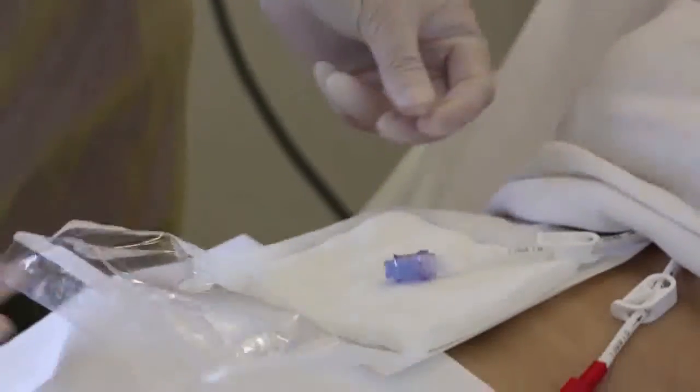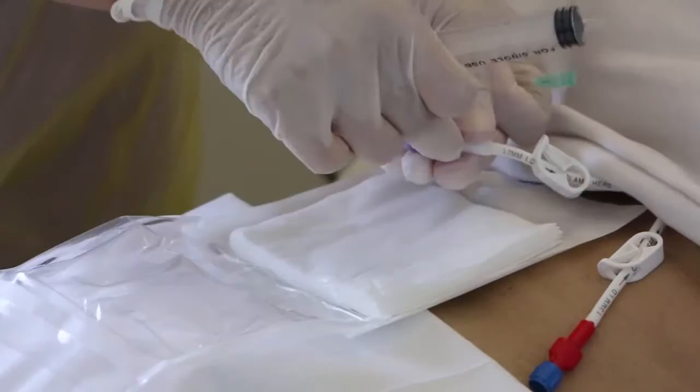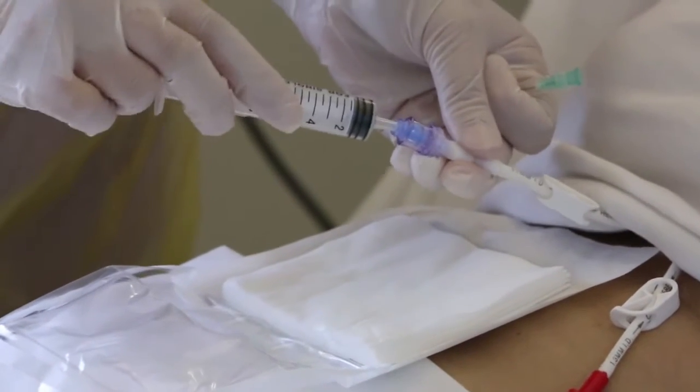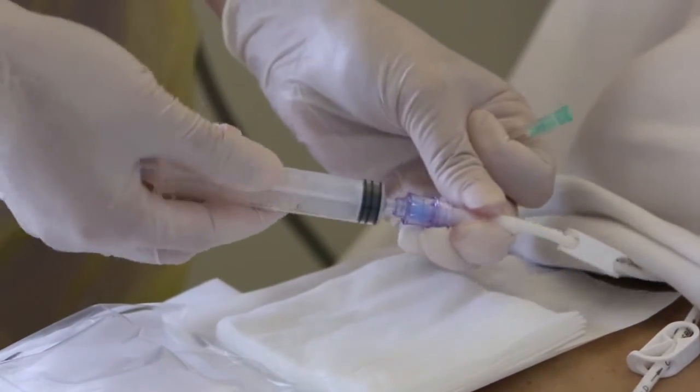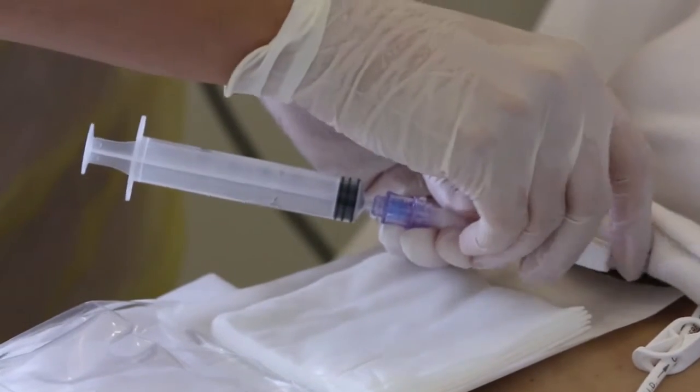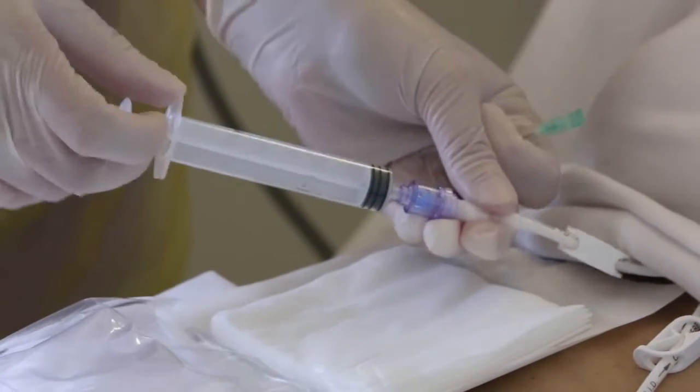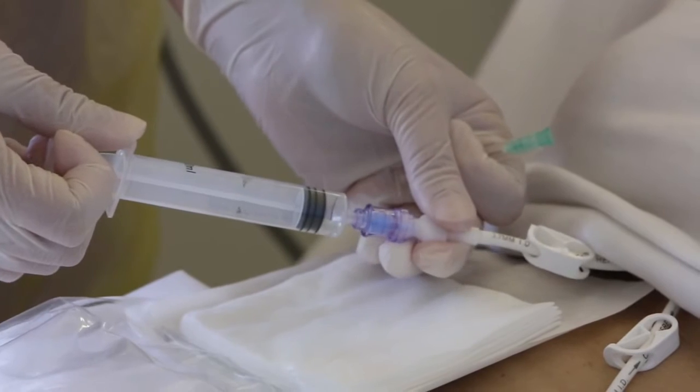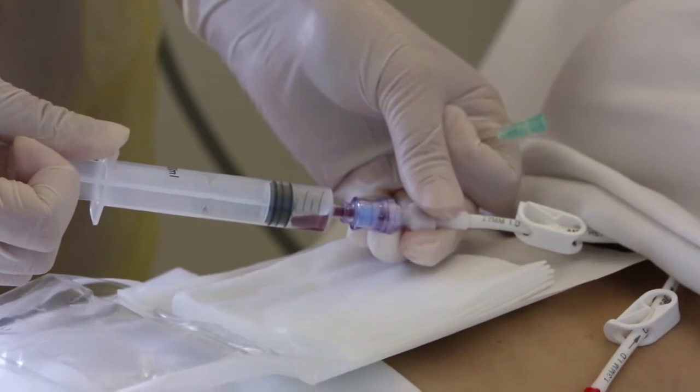Place the gauze swabs under the line port so that it is resting on a sterile area. Obtain the empty syringe from your tray, remove the needle and attach to the port as shown. Unclamp the line and aspirate a few ml of blood. Discard the blood-filled syringe and needle into the sharps box.